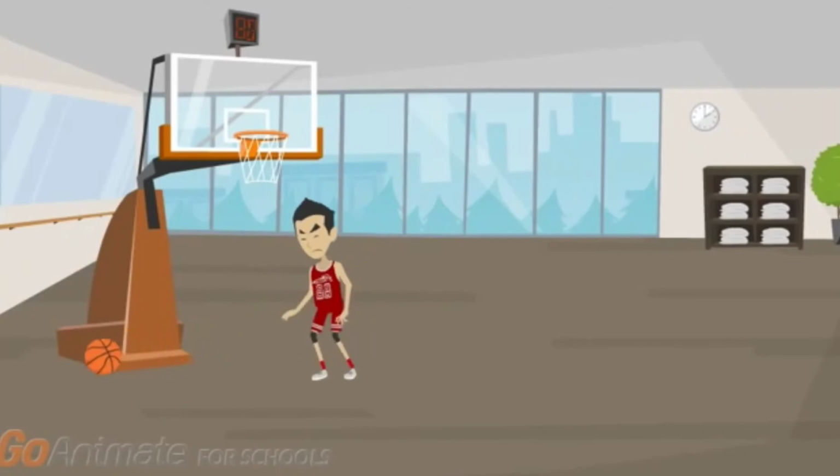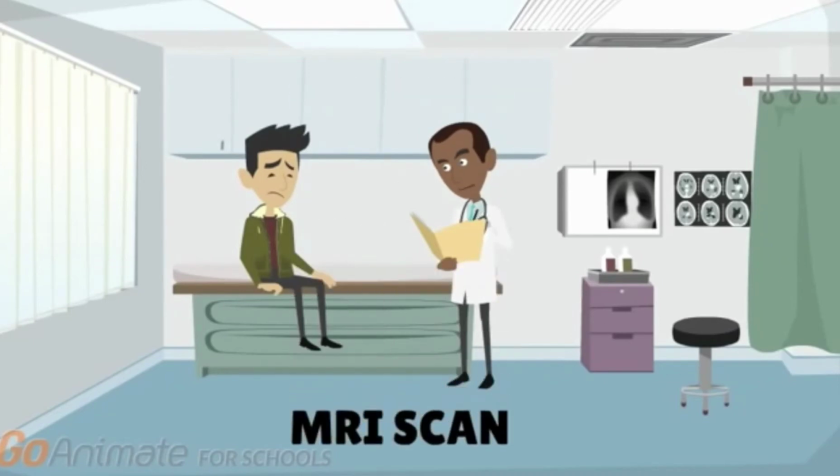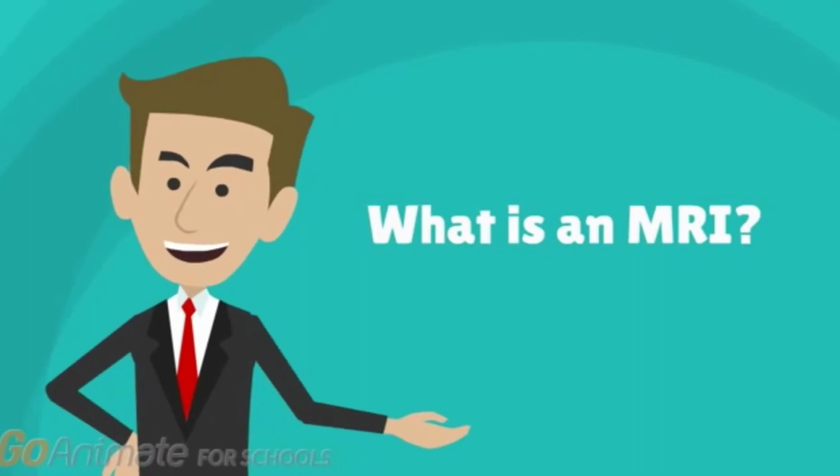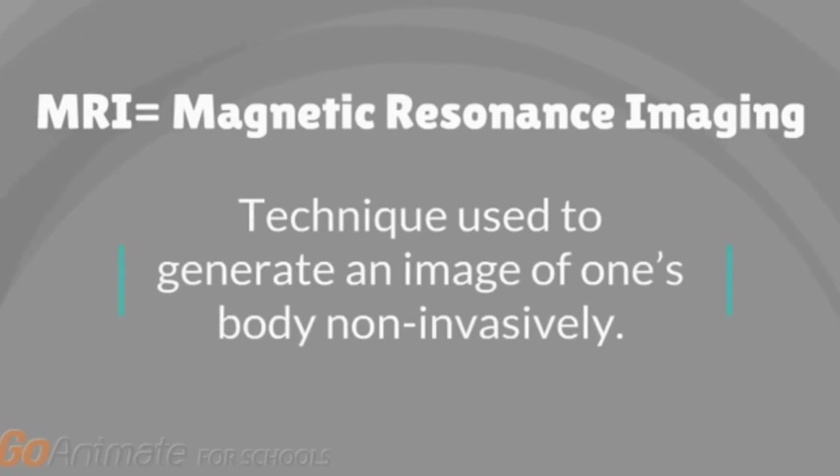Michael suffered a knee injury while playing basketball last week. After an appointment with his doctor, Michael finds out he'll be needing an MRI scan to determine if he needs surgery. Well, what exactly is an MRI? An MRI, which stands for Magnetic Resonance Imaging, is a technique used to generate an image of one's body non-invasively.